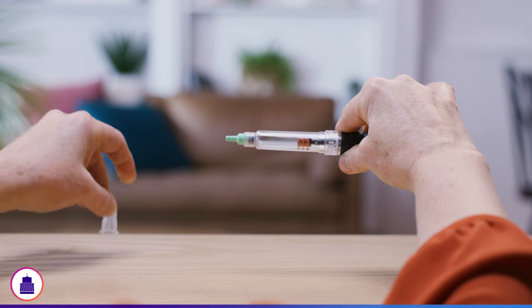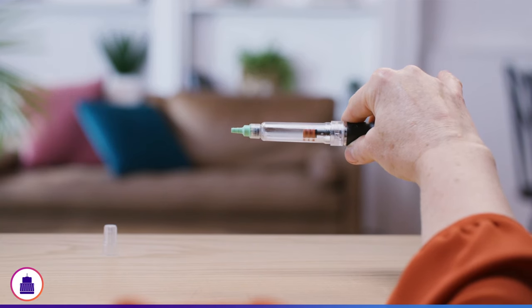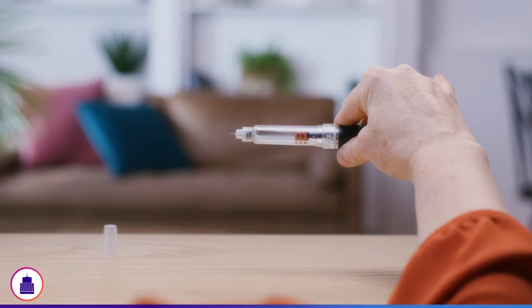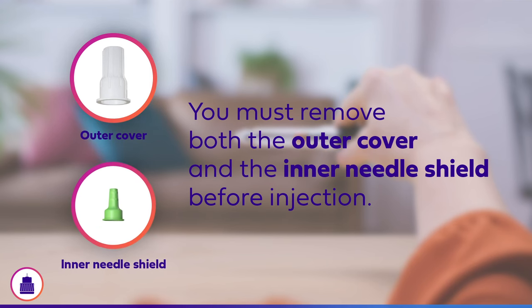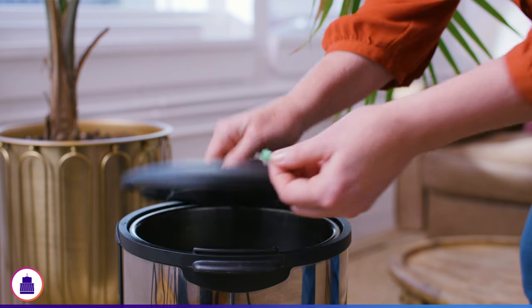Pull off the outer cover and set it aside — you may need it later to remove the pen needle. Remove the inner needle shield to expose the needle. It is important that you remove both the outer cover and the inner needle shield before injection. If both are not removed before use, the medication will not be injected, which can result in serious injury or death. Once the inner needle shield is removed, discard.